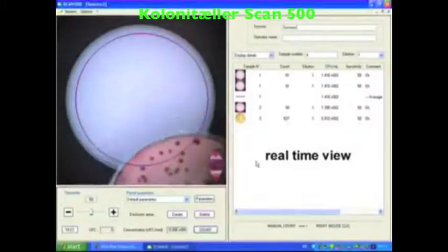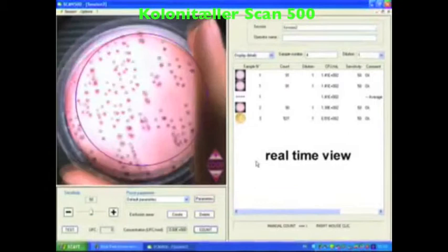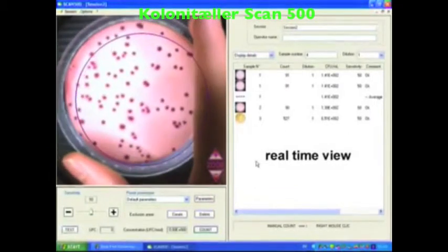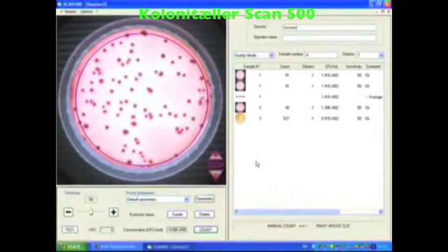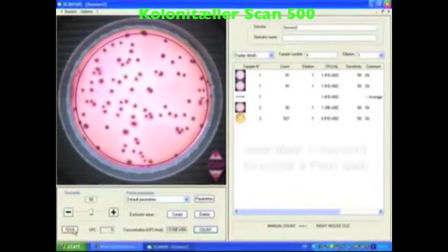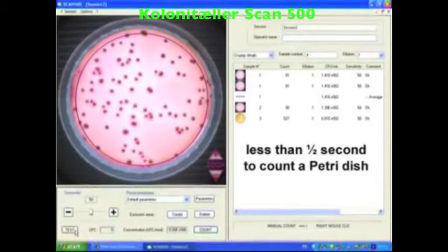Place your petri dish. Scan500 displays real-time views. In less than half a second your result is available.